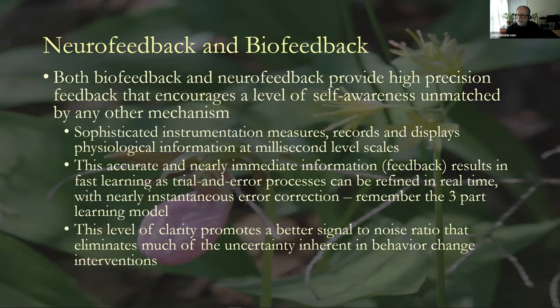We're talking about 100 milliseconds, 200 milliseconds, before we're consciously aware of those events happening, it shows up on the computer screen. And by doing that, it gives us this accurate and nearly immediate information, feedback, that results in very fast learning because the trial and error process can be refined in real time.